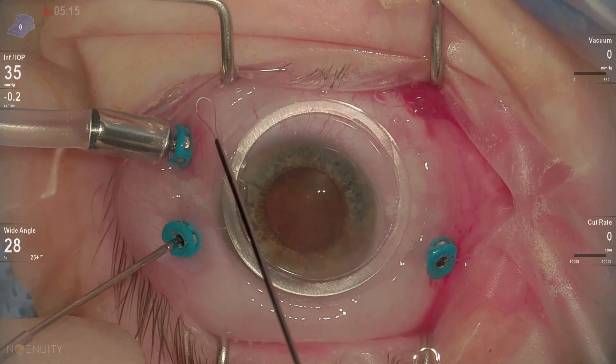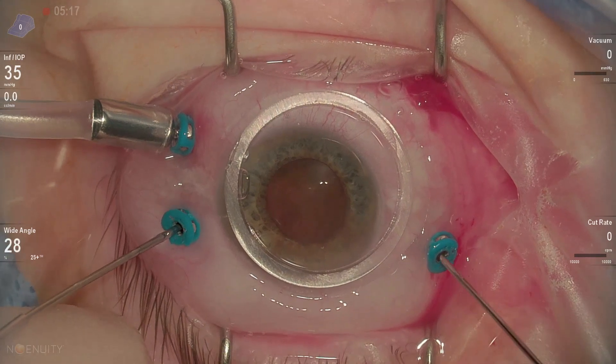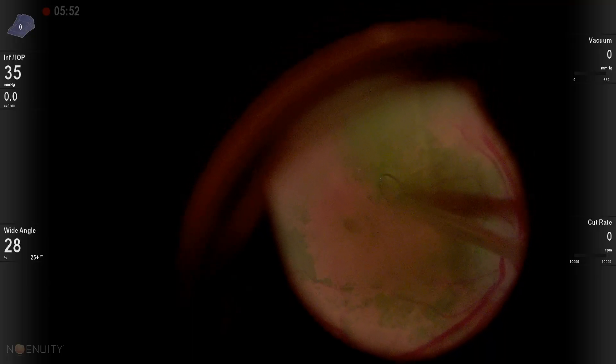After completing the core vitrectomy, I use this Alcon Flex Loop. It's replaced the Tano brush in many instances.